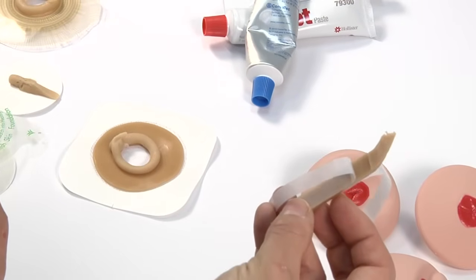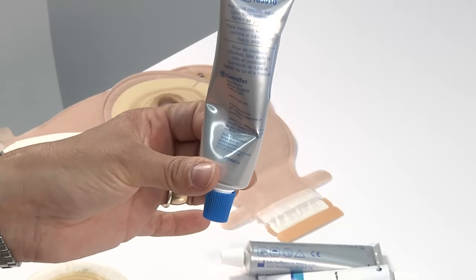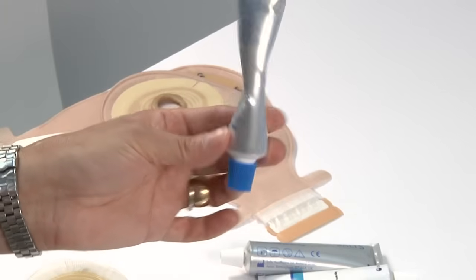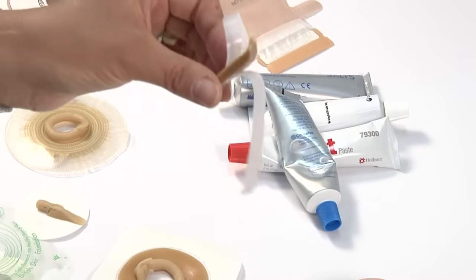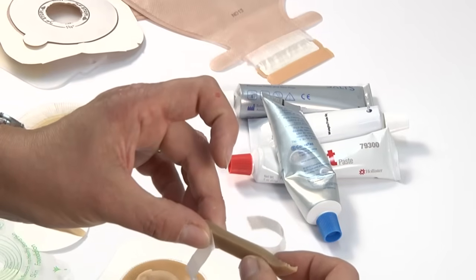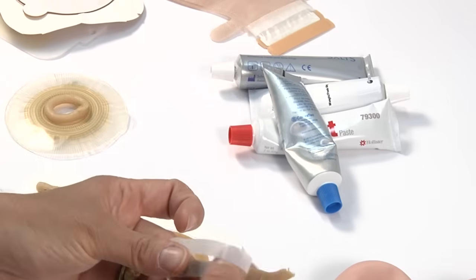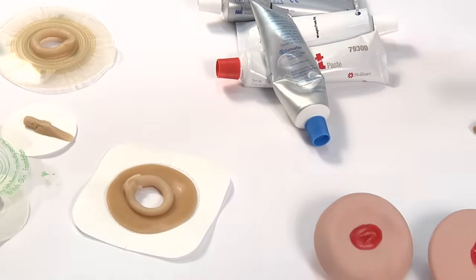The one thing that I forgot to talk about was the amount of dosing that you can get out of a typical tube. A patient would probably get about a 2-month use out of this, and most tube pastes are probably in the range of about $17 to $22 for a single tube. Strippaste, depending on how you're utilizing it and how large the stoma is, you can either get a single use out of it, or you can get multiple doses out of it. And these are a tad over $3 each. So again, it may be cost effective depending on what your utilization is for that particular individual.